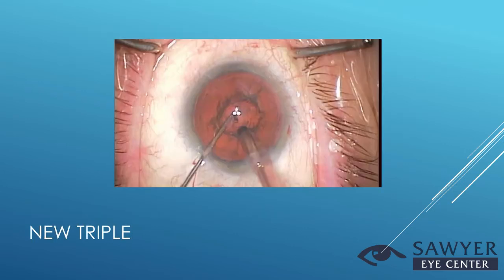The old triple procedure was a PK, cataract surgery, and intraocular lens placement. The new triple procedure is a DMEK, cataract surgery, and intraocular lens placement. And this is a little video just walking you through it in case you've never seen a DMEK before and kind of explaining the steps. Hopefully you've got to see a DMEK or at least see patients who've had it in the past, because it is very, very impressive when you compare it to PK especially, but even to DSEK as well.